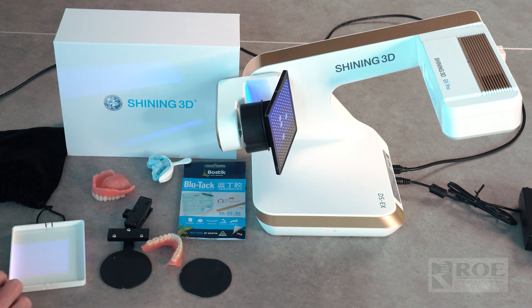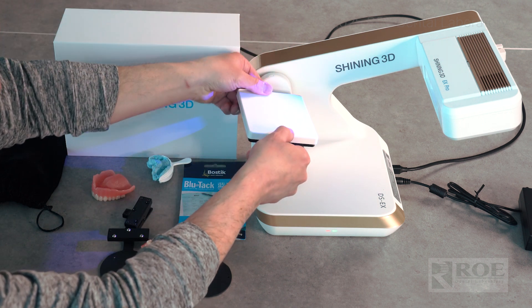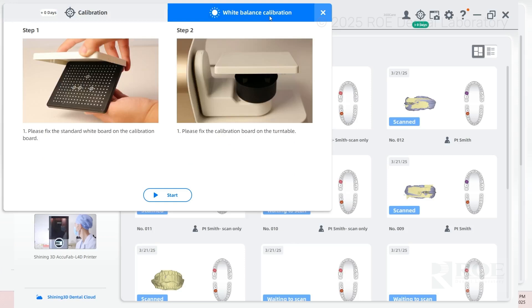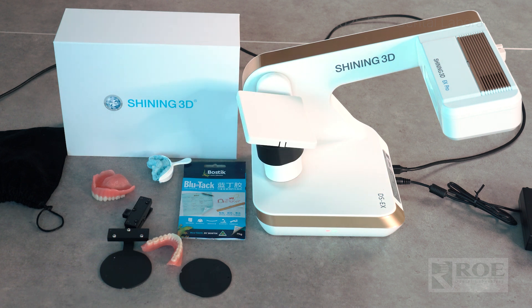Before the white balance calibration, you have to put this plate on the calibration device — you'll hear a little snap. Then click here and start. This is important because it captures all the light throughout the room and makes sure the scan is very accurate. This is very quick and seamless. We are now done calibrating the device.